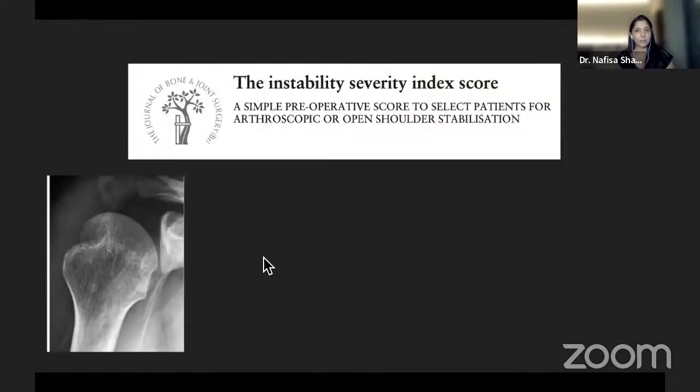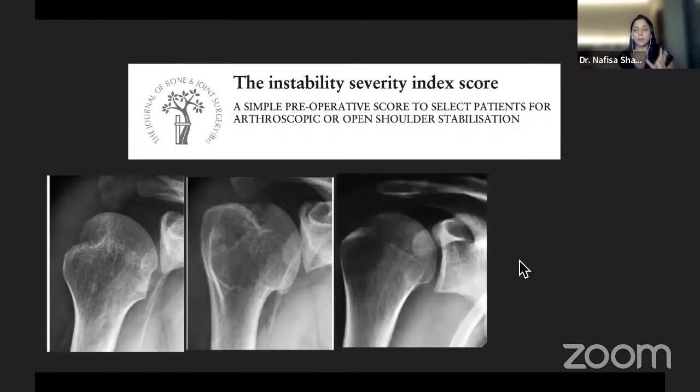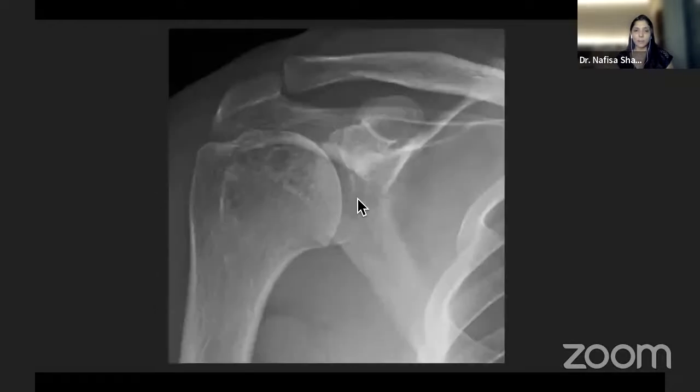When we talk about instability and severity index, initially, the only bone lesions were compared on the X-ray. So you'd look at the Hill-Sachs lesion in a regular view, in an AP view, in an external rotation, and if the Hill-Sachs lesion was well seen on external rotation, you'd say that there is a significant bone loss. A similar thing went about for the glenoid, where we look at this anterior sclerotic line and its continuity. And if it's missing, like in this case, where it stops short, we'll say that there is significant glenoid bone loss. Here you can also see a Hill-Sachs, and this was 16%.